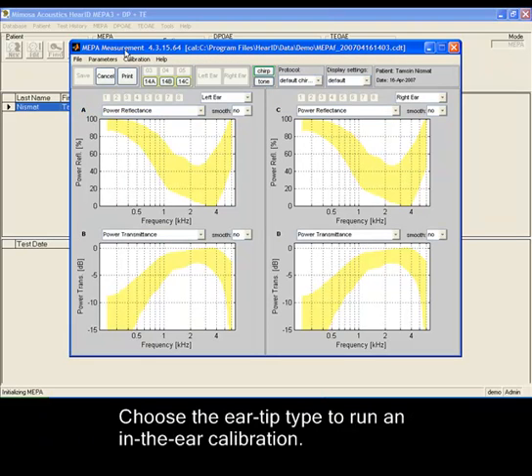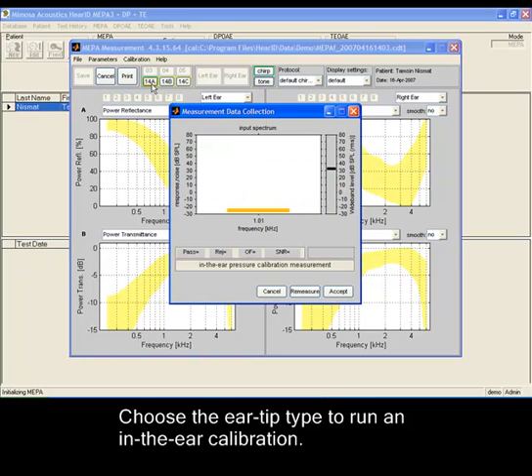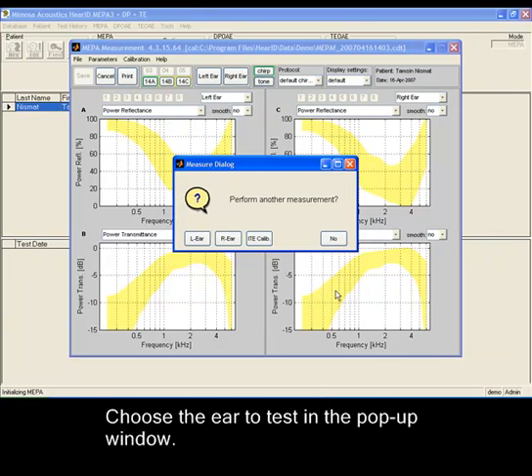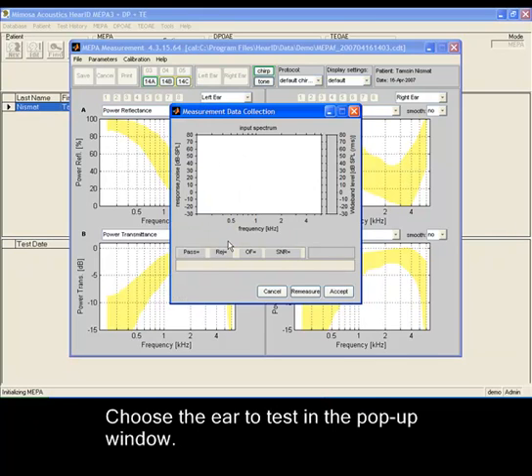Choose the ear tip type to run an in-the-air calibration. If the calibration is good, choose Accept. Then choose the ear to test in the pop-up window.